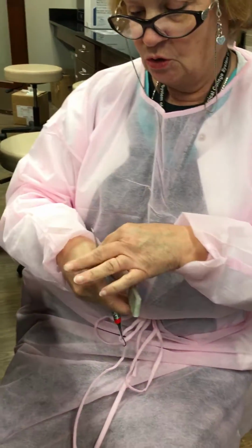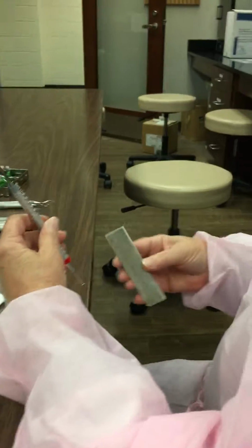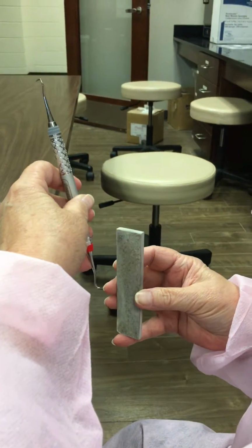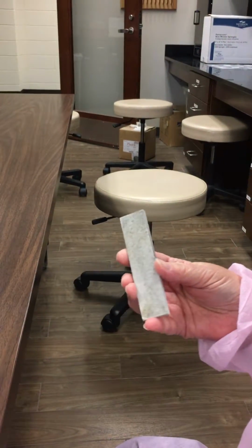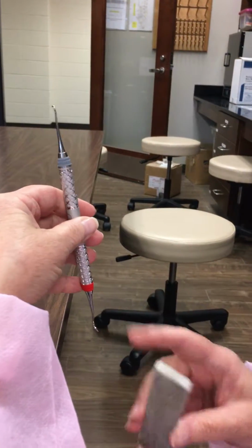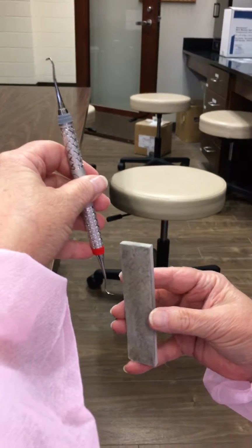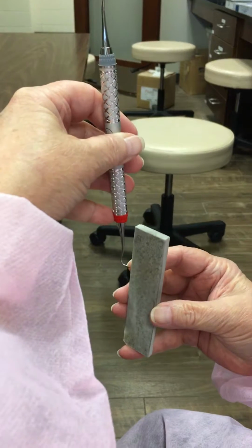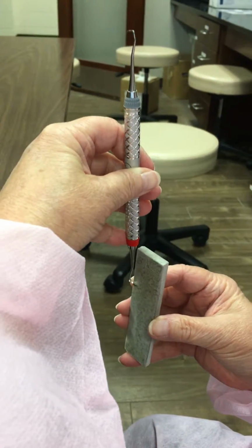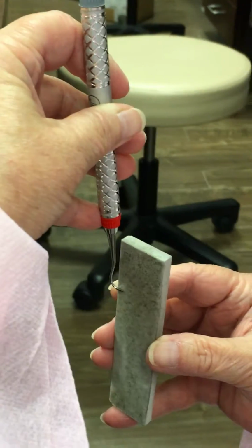Today we're going to learn how to sharpen with the moving stone and stationary instrument technique. We're going to start with our sickles, the H5 and the 33. The idea with all the sickles is going to be the same. We start with the stone at 90 degrees to the cutting edge of the instrument.